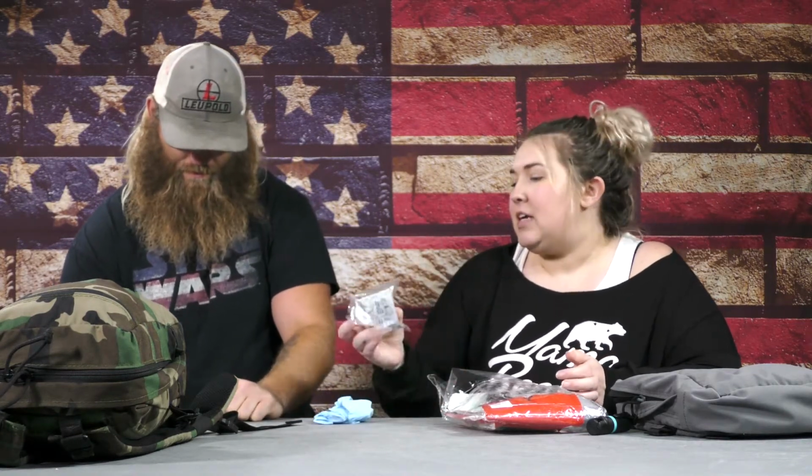Again, I think of everything from a mom's perspective. So I like elastic tourniquets better because they work on kids, dogs, everybody. I have seen these not do well on some bigger guys, but as far as the widest variation, these work. And we have talked about switching these to the rapid tourniquets. The rapid tourniquet's my favorite.